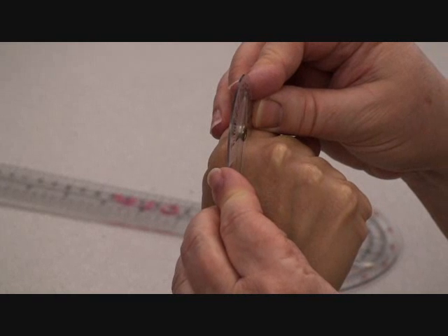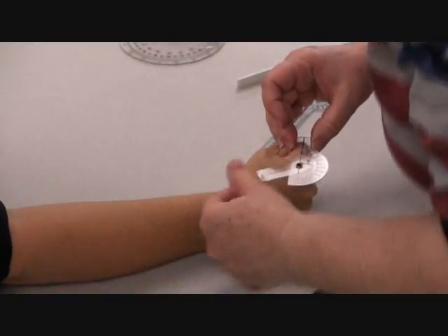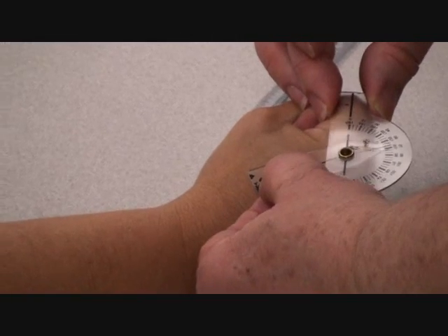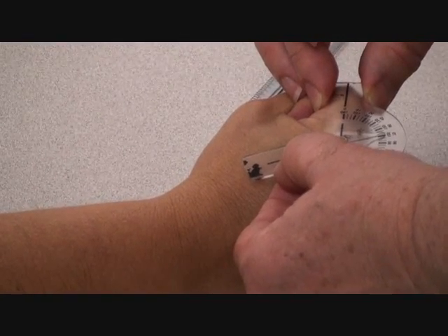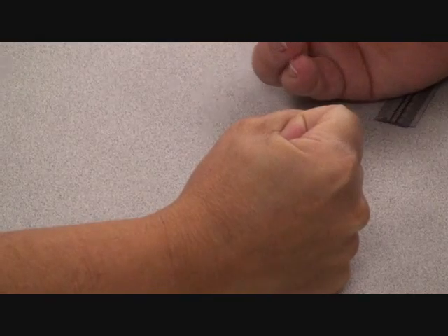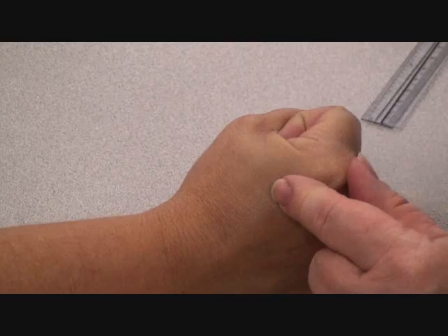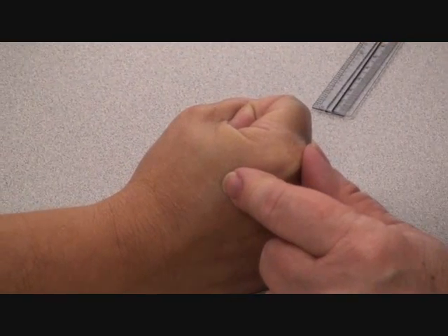So this is about 74. If I come off to the side, and if I'm over the top here, then I got 70. So that's only about four different. But what we had kind of said as a rule of thumb is that most of the time, the range of motion is higher when we're going over the top. So that's what we saw.